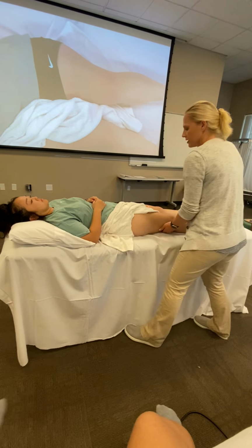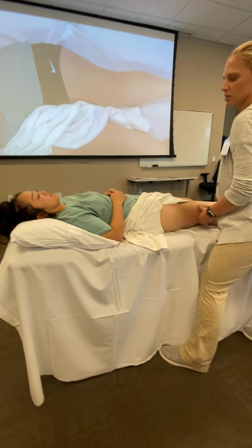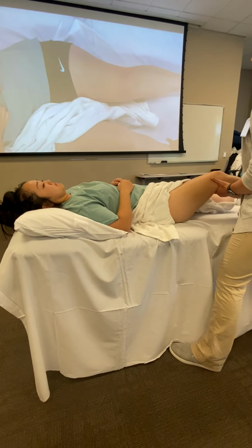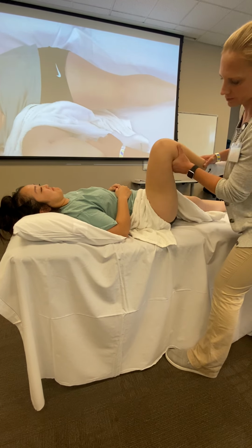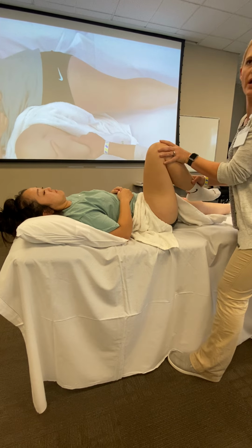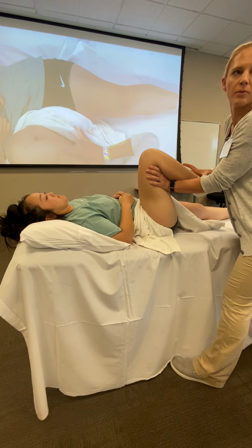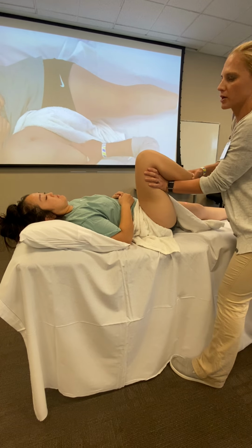So first, setup, I'm gonna palpate my landmarks. I have them exposed. I want you to breathe. Nope, too helpful. Just relax. Push. Ask your patient if they have knee problems. If you have your hand pushing on the outside of the knee or under the knee, just if they have knee problems, you don't want to be cranking down on that knee super hard.